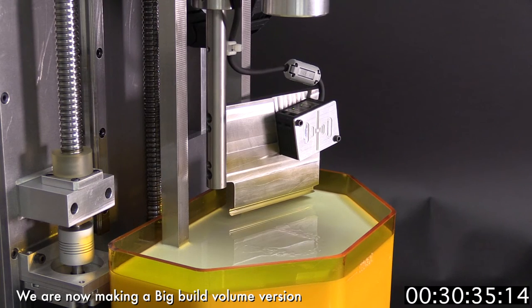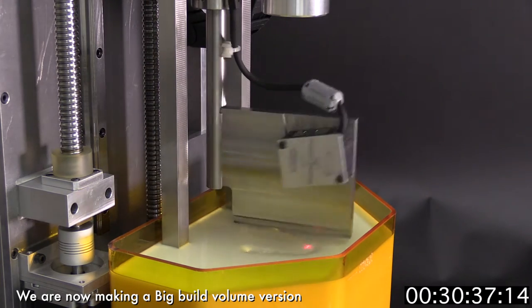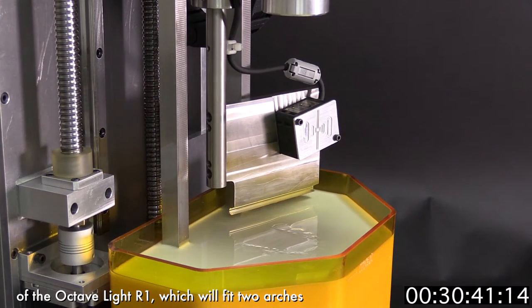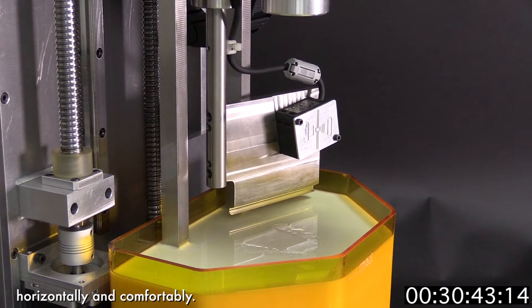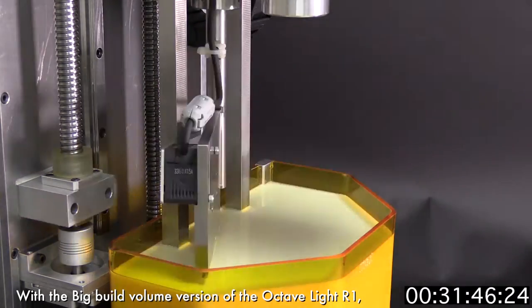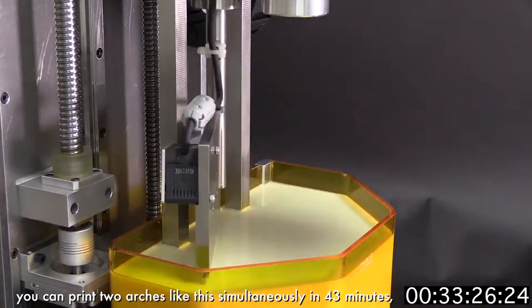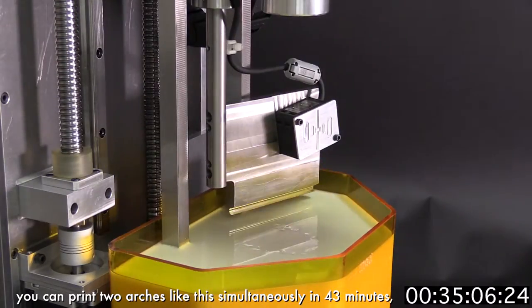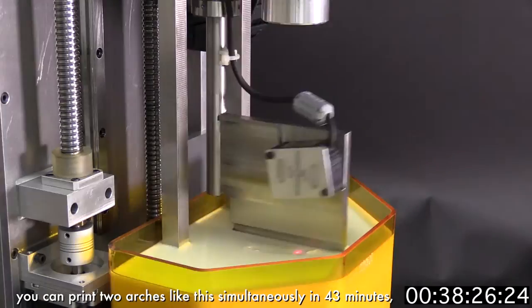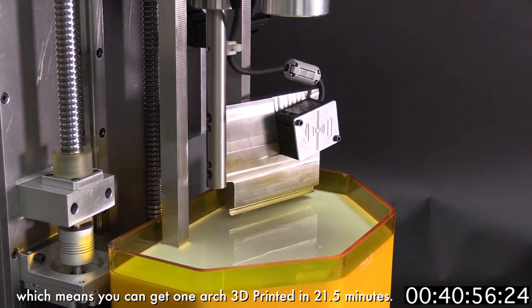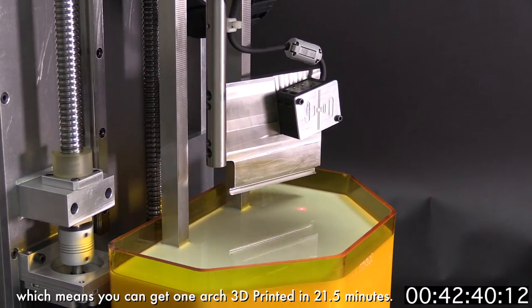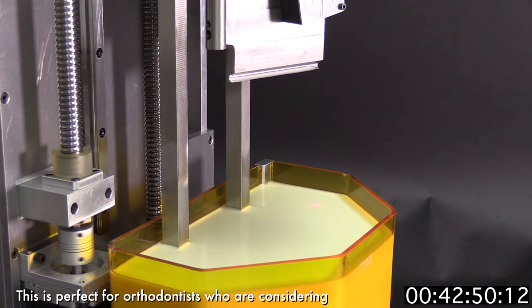We are now making a big build volume version of the Octav Light R1, which will fit two arches horizontally and comfortably. With the big build volume version, you can print two arches like this simultaneously in 43 minutes, which means you can get one arch 3D printed in 21.5 minutes.